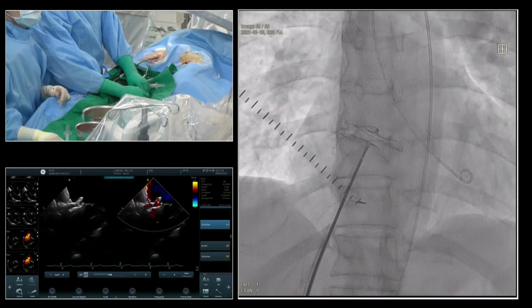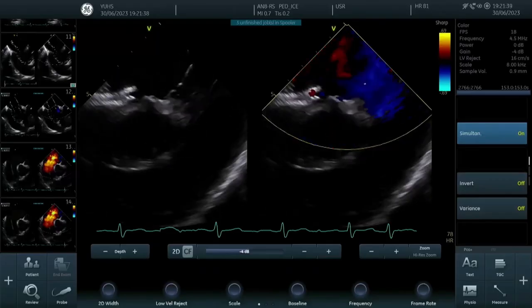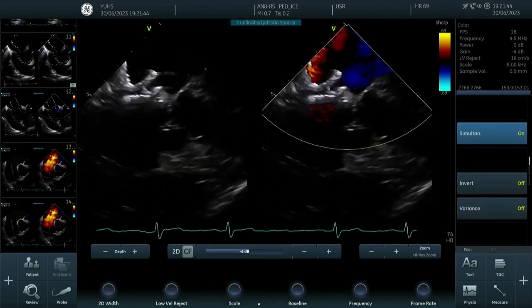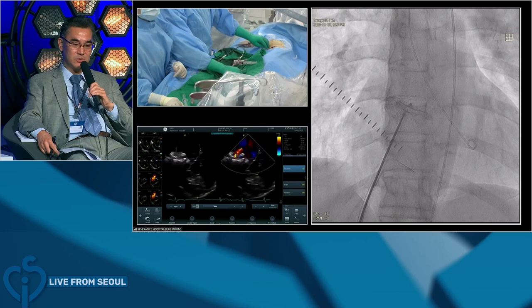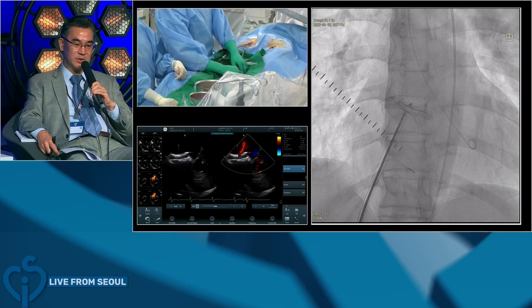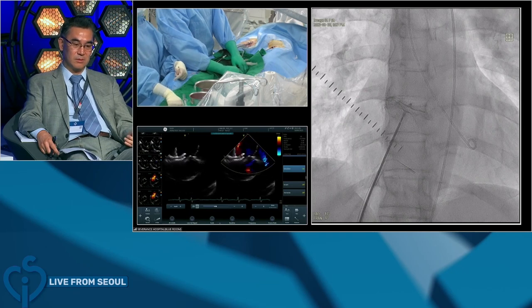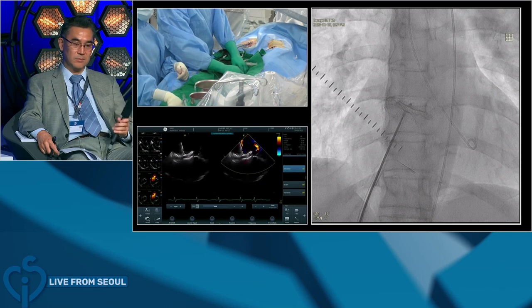This retroaortic rim is not caught, I think, but what do you think? Is that because of the septal malalignment? They didn't splay around the aorta? We didn't leave it on this side because we need to catch the, as you see, the retroaortic rim is going to be a little bit shorter. I think we need to make a shape in this particular anatomy. Actually, splaying around the aorta has been postulated as one of the mechanisms of erosion. But I don't know.